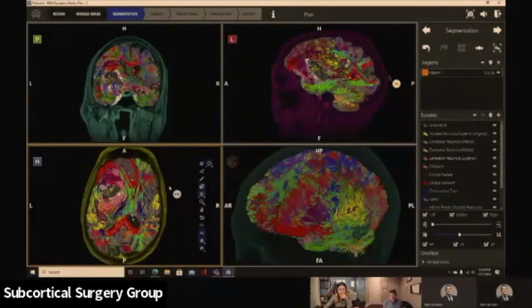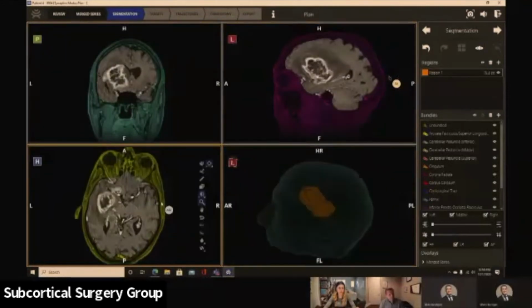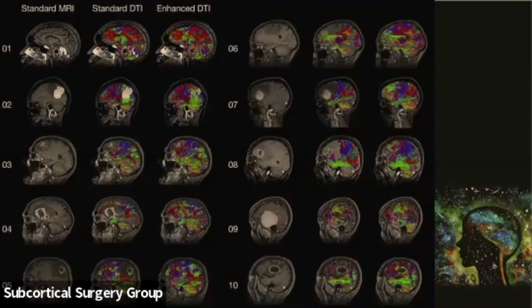The lesion is much tighter, but now there are artifacts, there are false fiber tracts in the necrotic tumor core and in the CSF spaces, but there's certainly a lot more data there than in the previous uncorrected versions. Right, the videos won't play, so we'll just go to this.